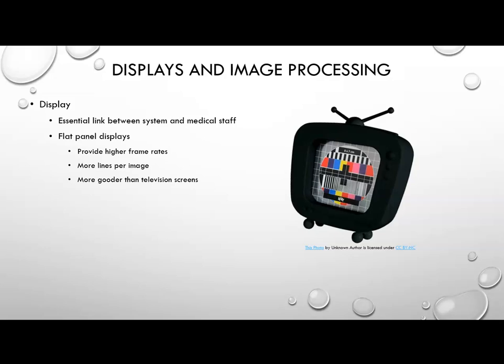With that, you get higher frame rates and you get more lines per image. When I say higher frame rates, the televisions, as we know them, have a standard frame rate of 30 frames per second, which is actually very low.